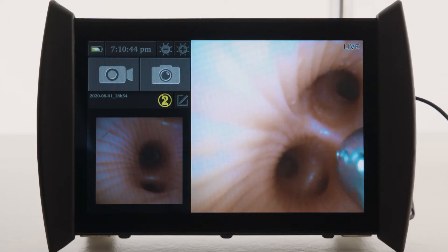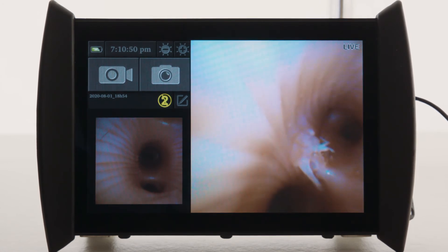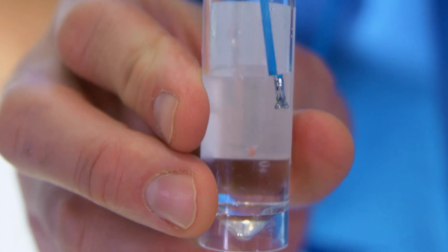The assistant opens and closes the forceps when prompted, and the sample is placed in a specimen cup.